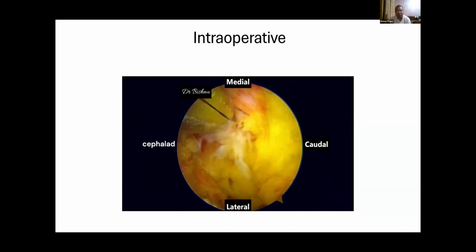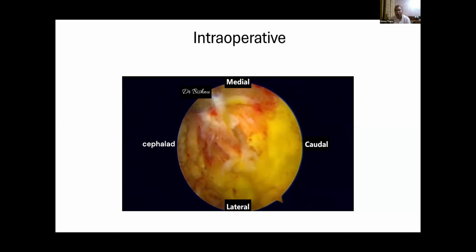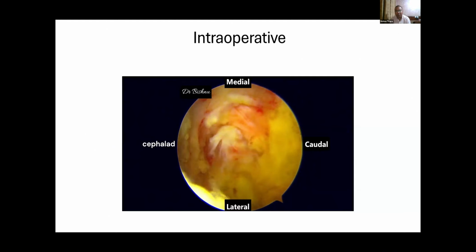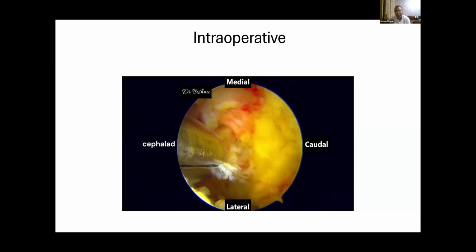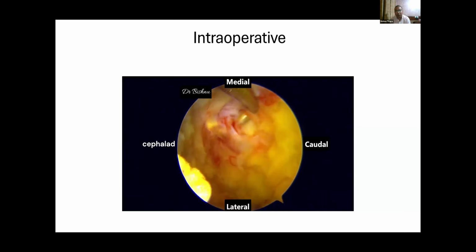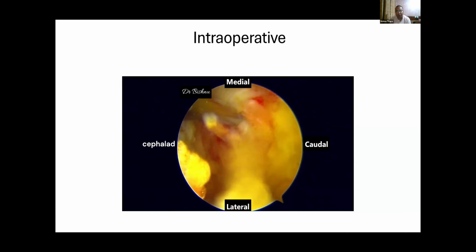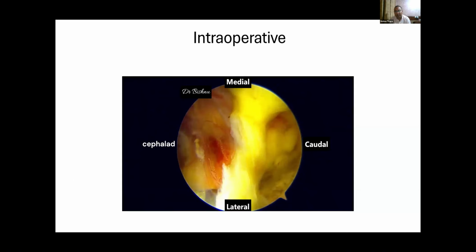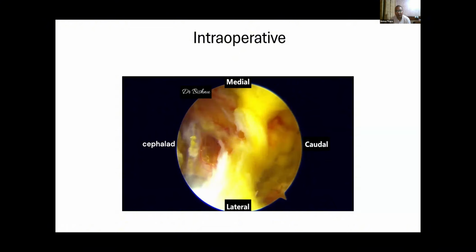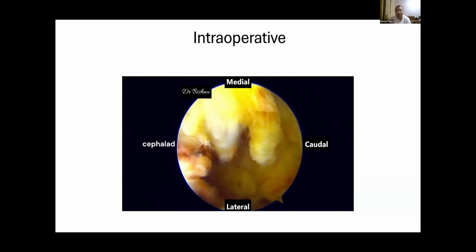So, I did this Cauda Equina syndrome case with the UBE technique. Although I'm sorry that the video is not clear, I removed part of the lamina using a 3 mm diamond burr, exposing the neural structures. The neural structures are very tight due to the large fragment. Initially I removed a few fragments piecemeal. Usually I do not remove the whole ligamentum flavum, but in this case, because of the large fragment, it is difficult to mobilize the neural structures.